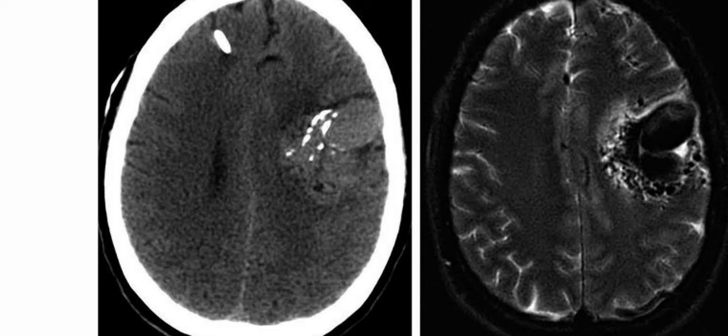So as you can see, on the CT scan there is a hyperdense mass with calcifications and mild surrounding edema within the posterior left frontal lobe. A ventricular drainage catheter is partially visualized within the right frontal lobe. On the axial T2 weighted MRI sequence, you can see that there is a nidus of enlarged serpentine flow voids with a large venous aneurysm laterally.